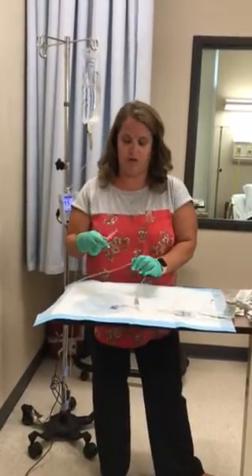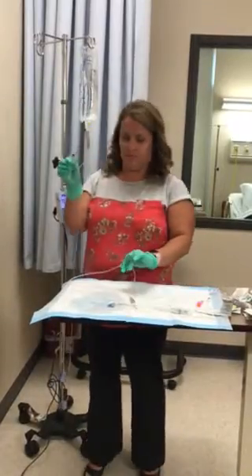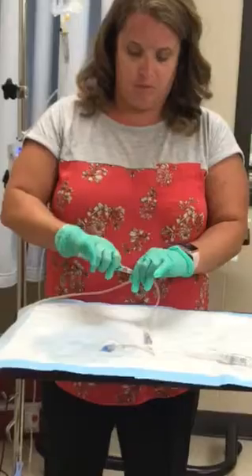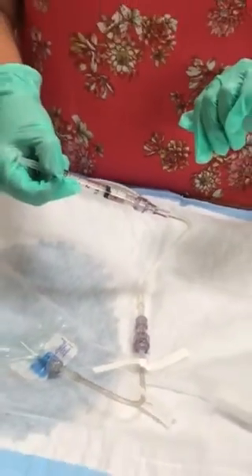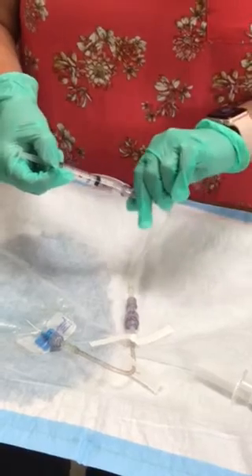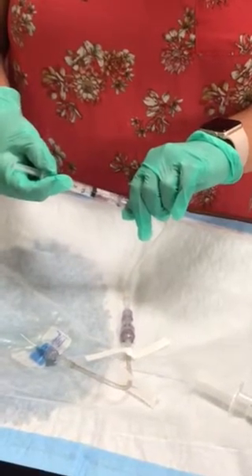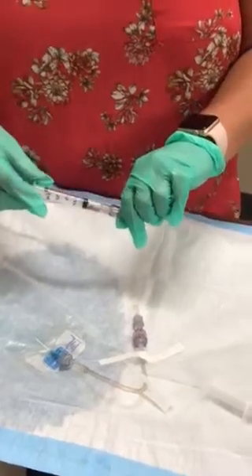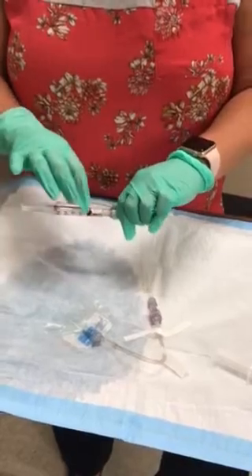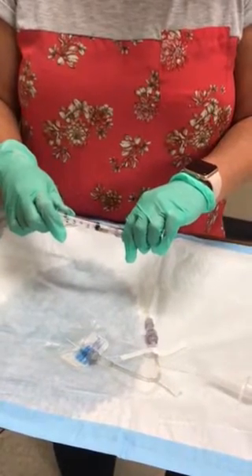As you're in your last year of nursing school, you want to keep lots of alcohol pens in your pocket so you're ready to clean anything. I have my little syringe and I'm going to screw this on. I'm going to push, and then I'm going to wait 15 seconds — that's why you need to have a real second-hand watch so your watch doesn't shut off. Every 15 seconds you're going to push, because 120 seconds divided by 10 lines equals 12 seconds per line, and you round up to 15.